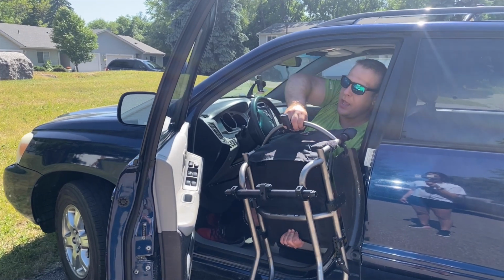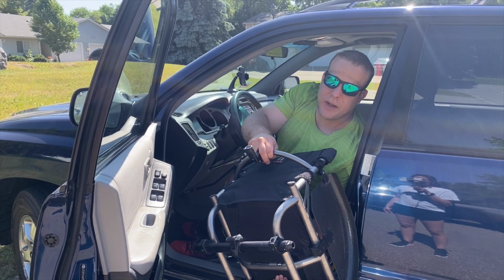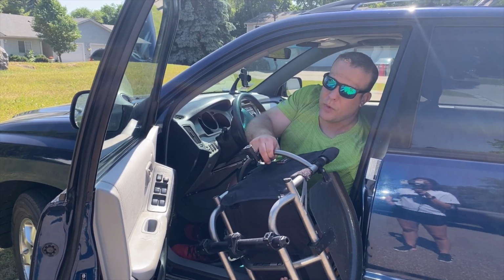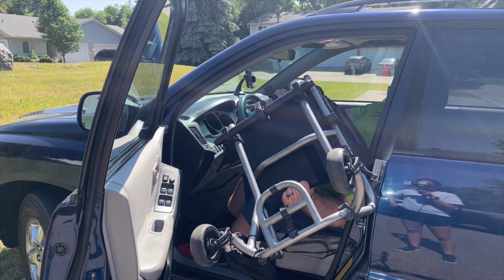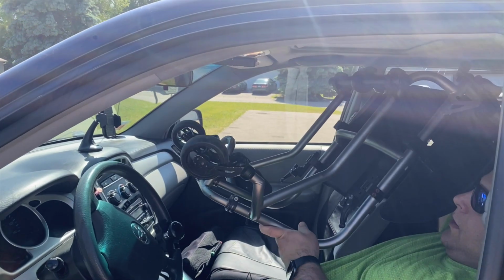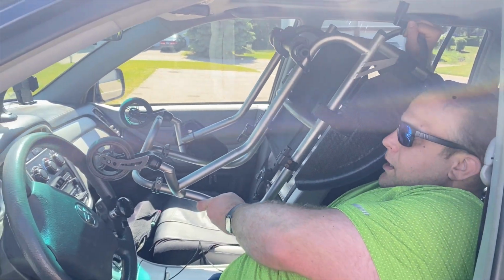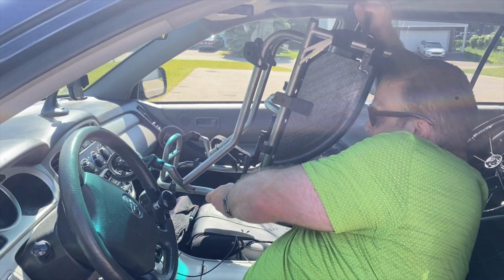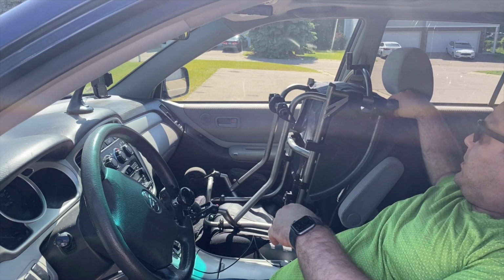So then I'm here, and I have enough trunk stability and stuff, which some people might not, but you just have to figure out what works best for you as you try different things out. But now I can twist, and I bring it across my lap, and then here again, I'm trying not to lift too much with my right hand and keep the weight in my left hand, and then set it down in my passenger seat.